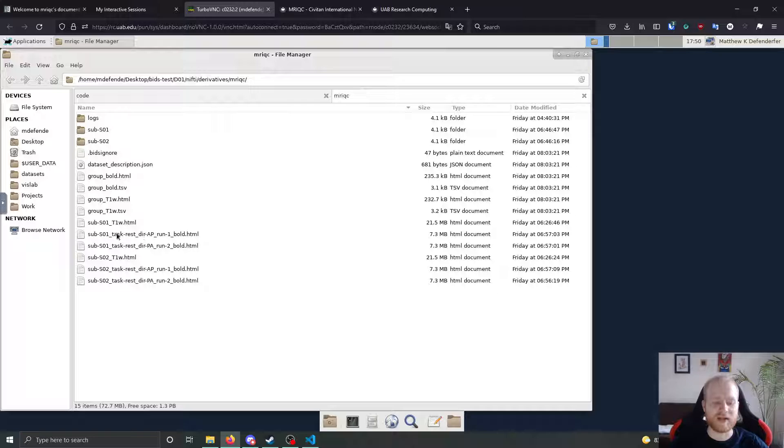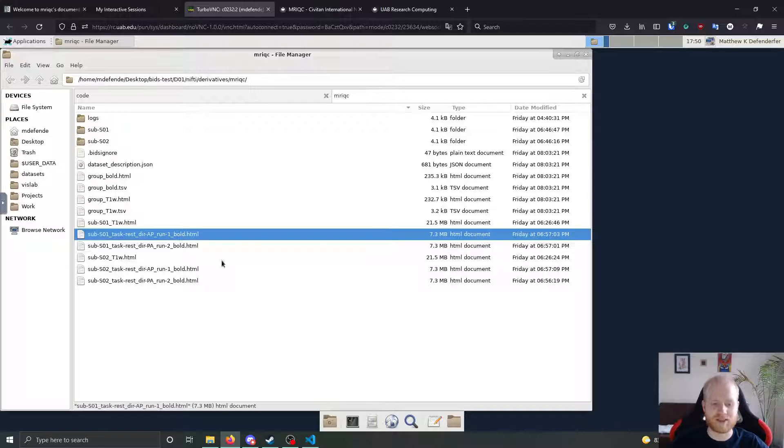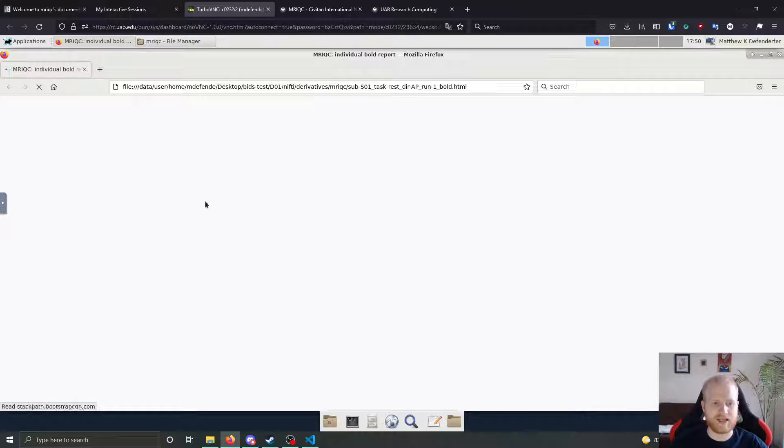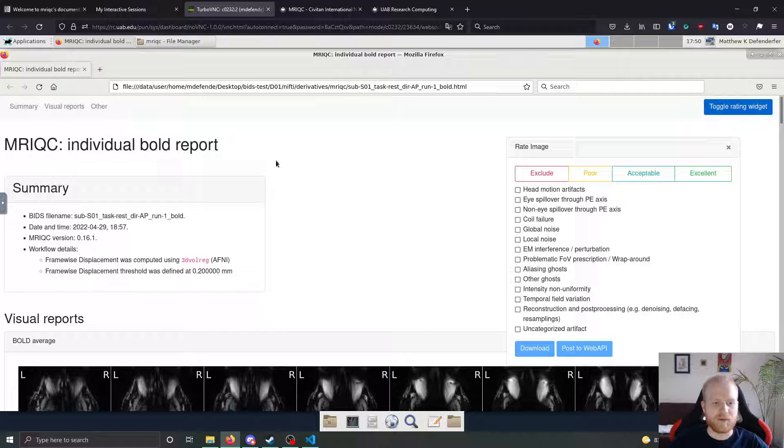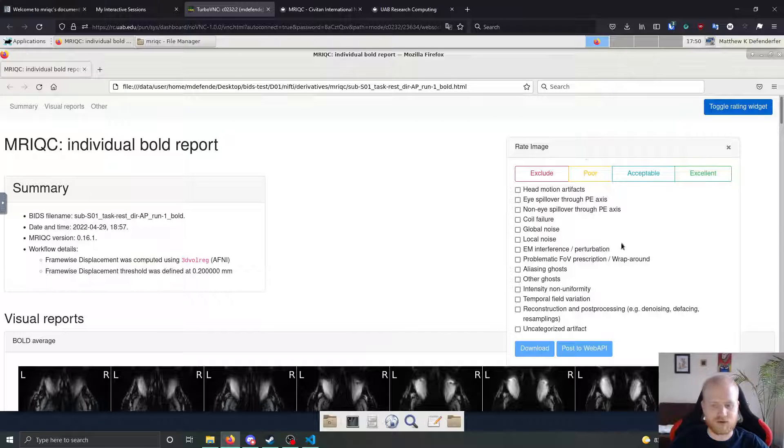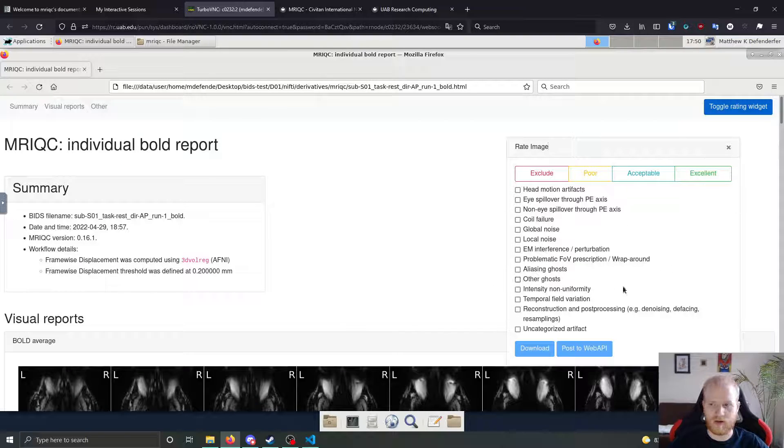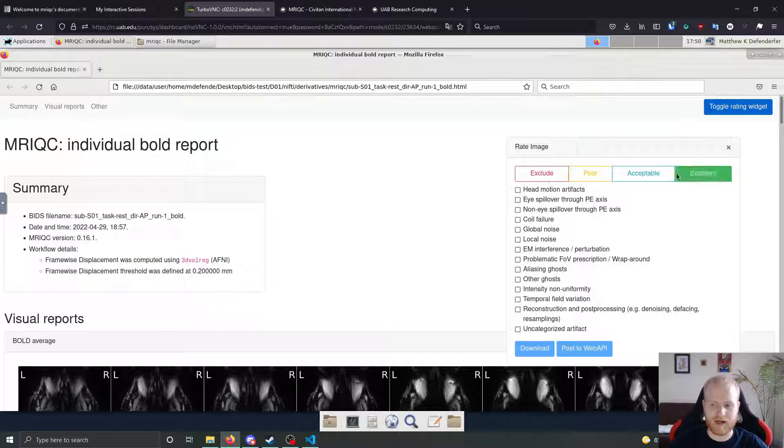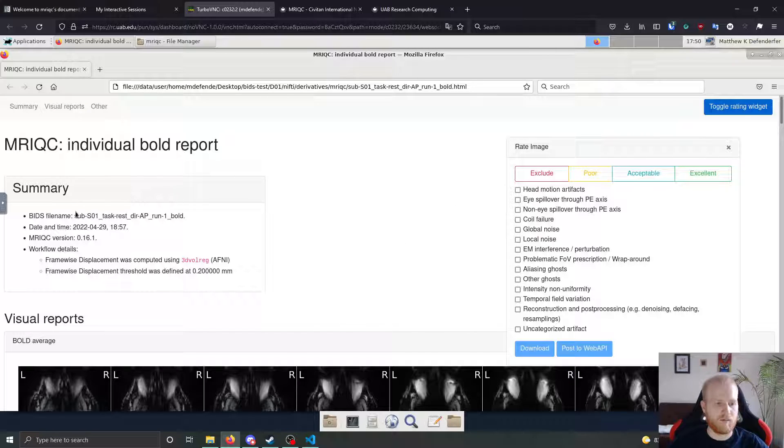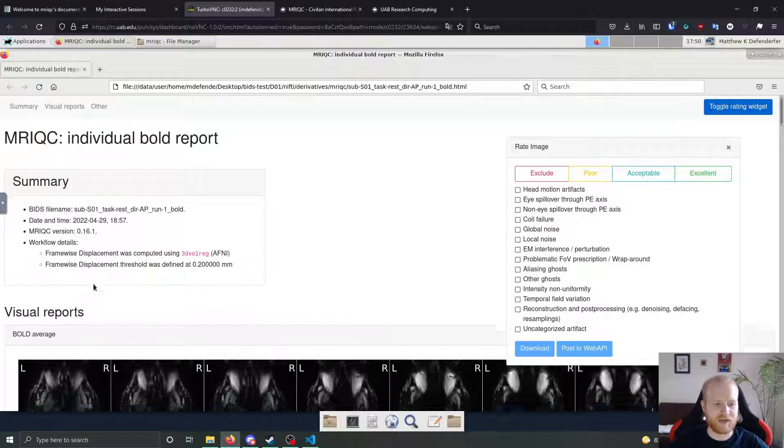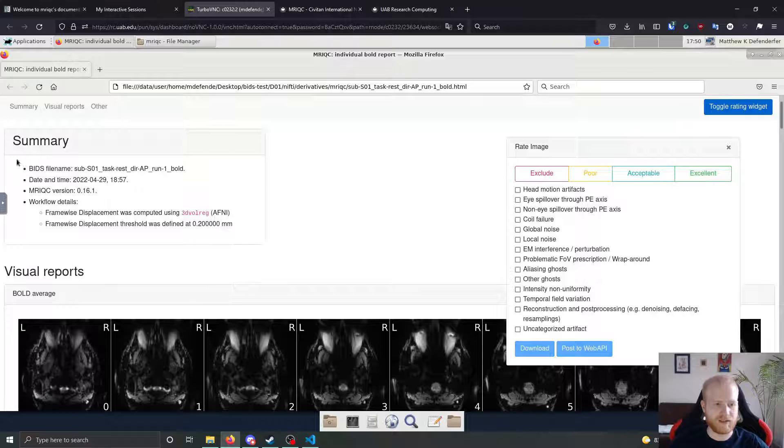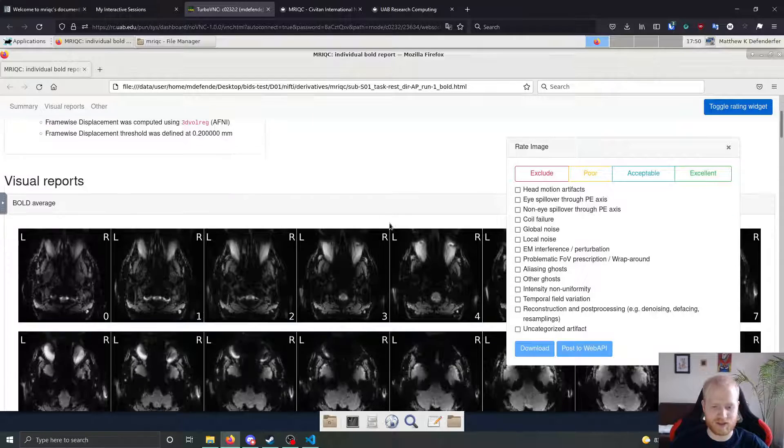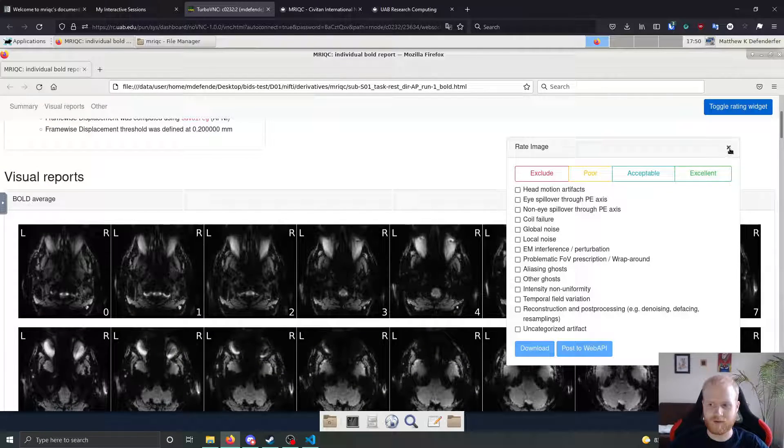But if we look at the bold images, we get the same sort of thing. So we open up the bold report has the same sort of rating widget over here that you can use to mark it as whatever you want. The same thing with the workflow details, bids name, date, time, MRI QC version, so on and so forth.